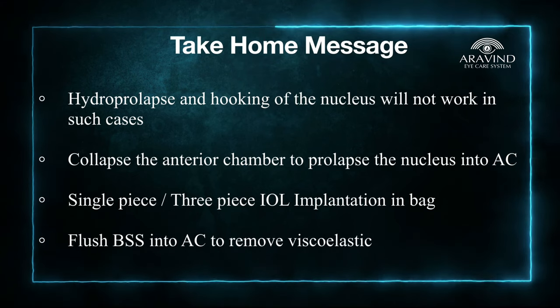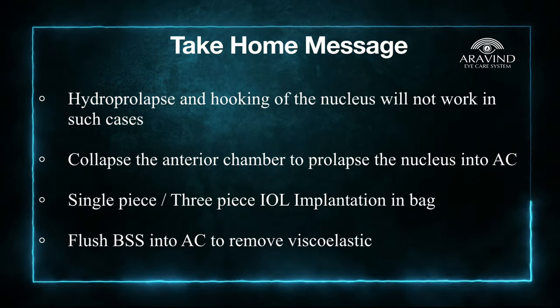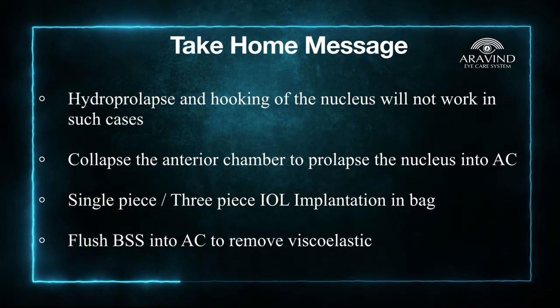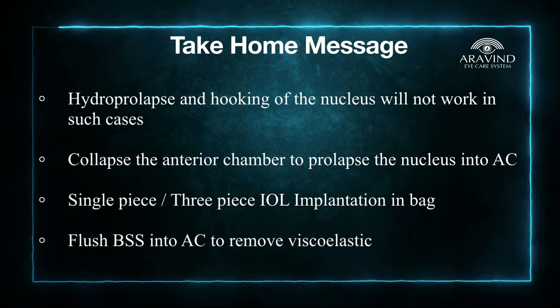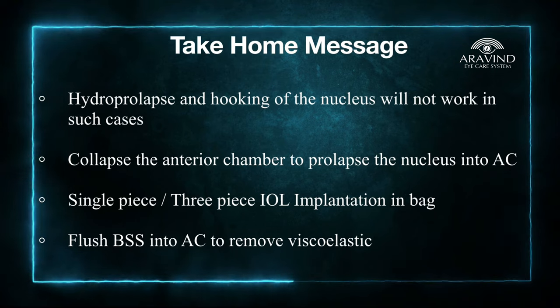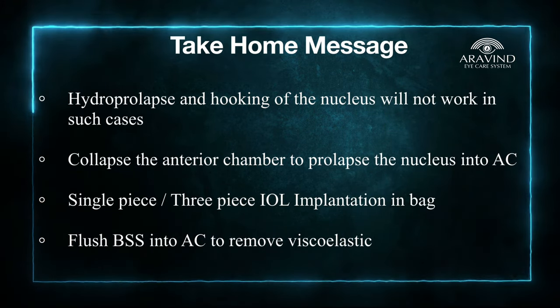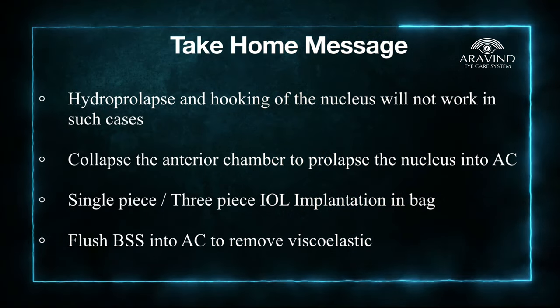Hydroprolapse and hooking out the nucleus will not work in such cases because the nucleus is very dense like a marble. So the best way to do this is collapse the anterior chamber, which leads to the shallowing of the bag and thus brings the nucleus into the anterior chamber. Fill the anterior chamber with viscoelastic. Visco delivery or vectis delivery of the nucleus can be done. Single piece PMMA lens or a 3-piece PMMA lens can be placed in the bag.